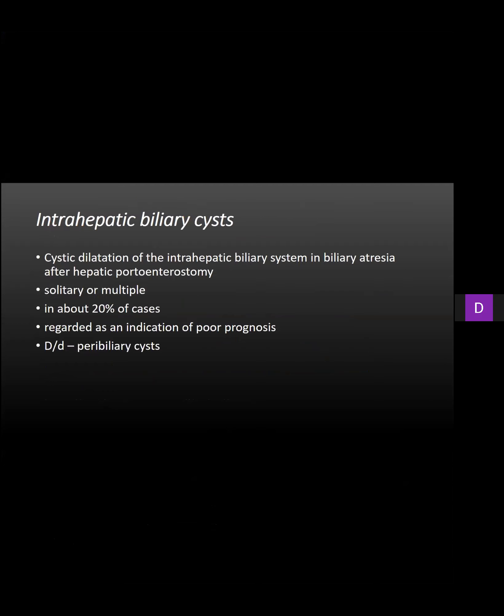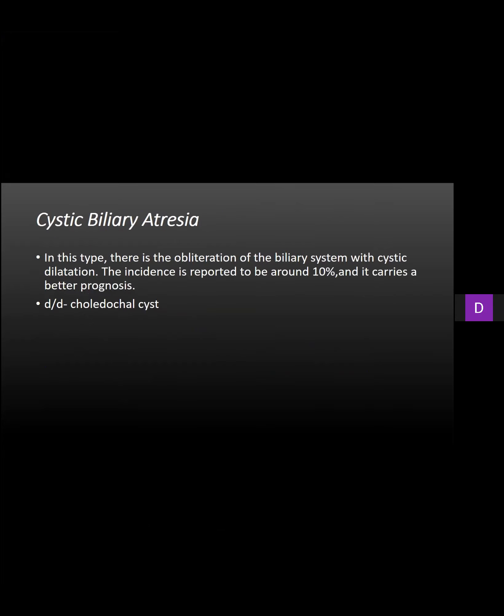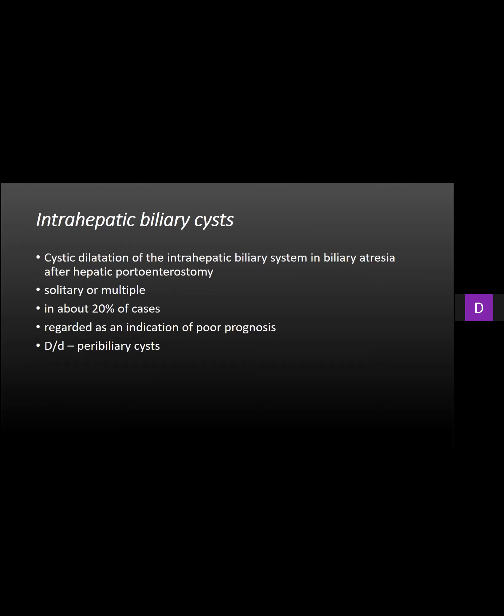A majority of these patients develop dilatation of the bile ducts — intrahepatic biliary cysts — just cystic dilatation of the intrahepatic bile ducts. The significance is that whenever these form, it indicates poor prognosis, predisposing the patient to repeated episodes of cholangitis. The closest differential is peribiliary cysts, but these are not peribiliary — they are dilated bile ducts.